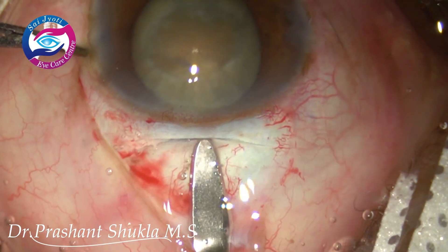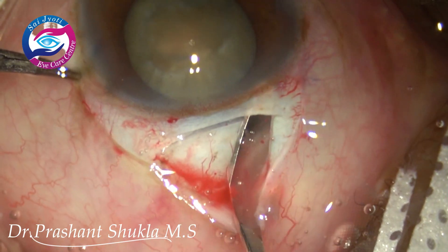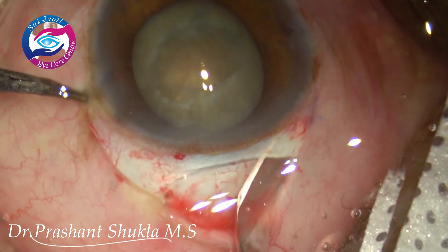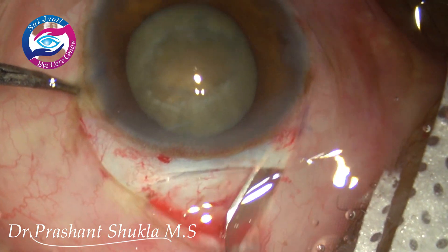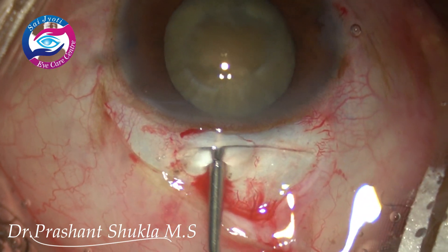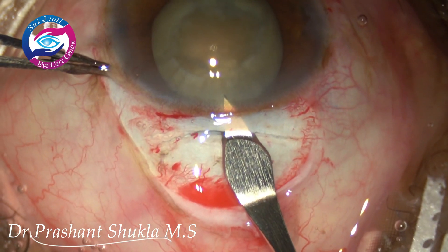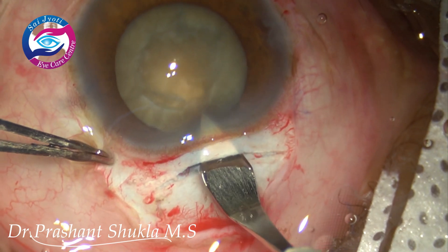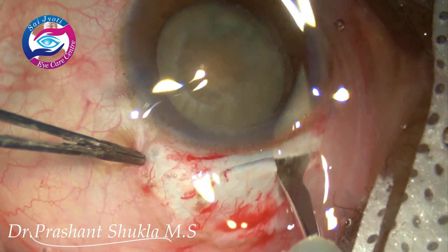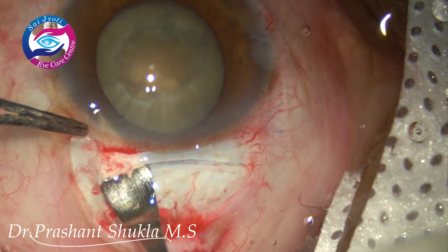Considering the size of the nucleus, we need a good scleral opening because I would never want the nucleus to get stuck in the tunnel. The tunnel is extended on the other side as well with the same wriggling movements and scleral pockets are being created. Here is a small trick — I am putting some viscoelastic just to mark the inner lip of the tunnel. Now with the help of a 2.8 keratome, I am entering the anterior chamber, cutting only while moving forward so we can have a very smooth inner lip almost parallel to the limbus.